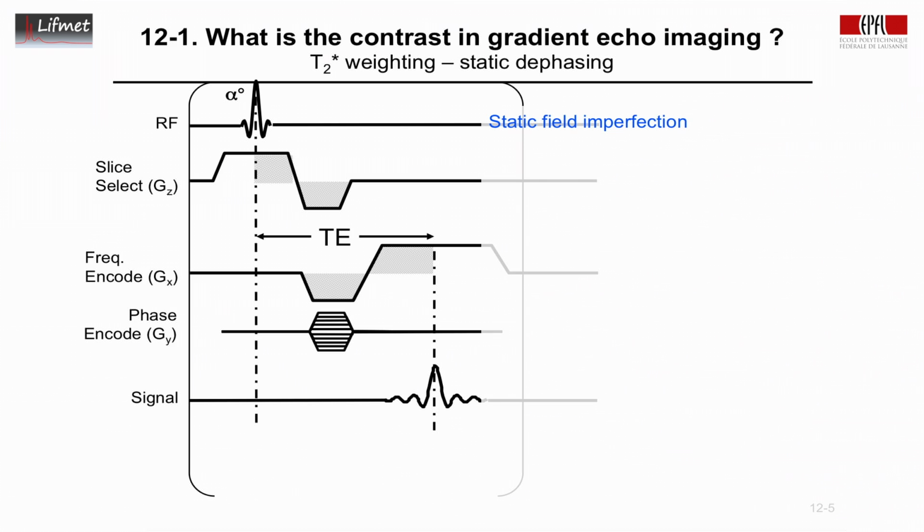So far, when I've introduced the relaxation times, we have dealt with B0, aside from the gradient that we introduce in the scanner, as perfectly homogeneous in space. And this is unfortunately not true. In very general terms, we can write the static magnetic field B, around which the magnetization precesses, as B0. We have the gradient term, which can be time variant, times the position, plus a term delta B of r.